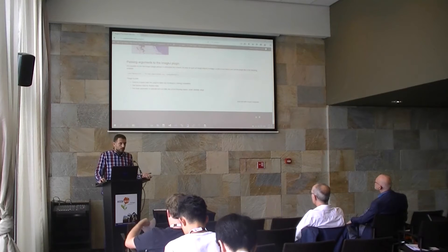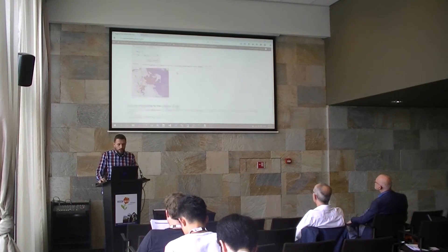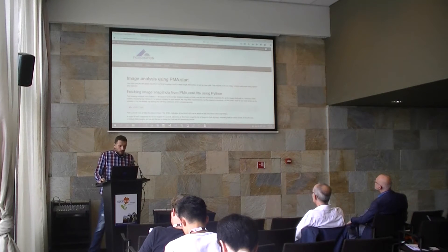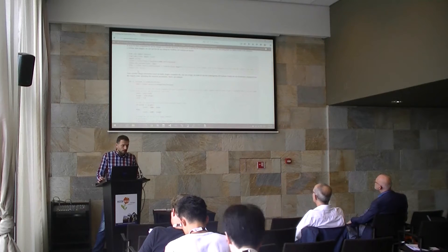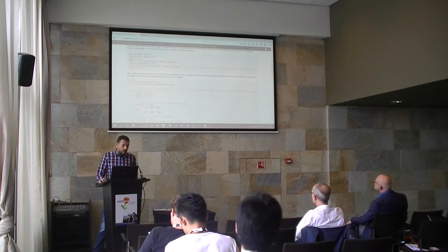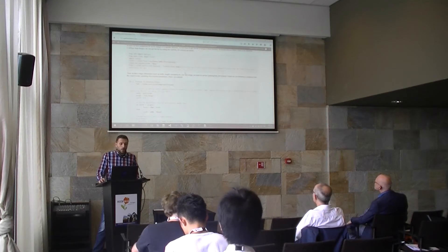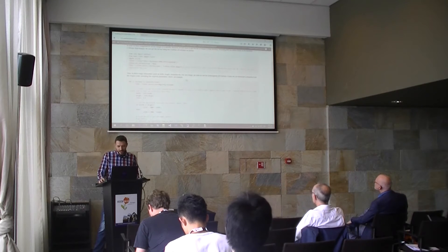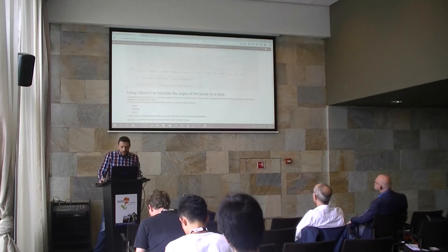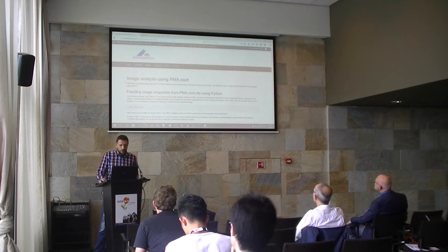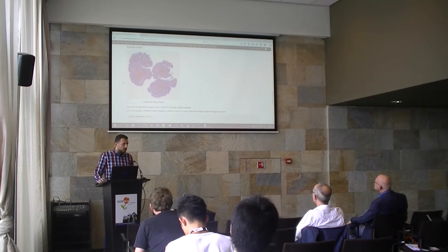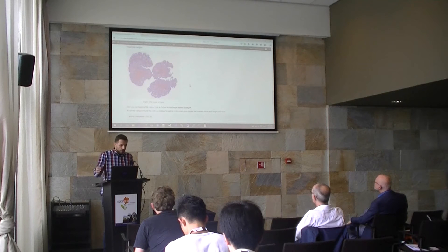All this information is available on our website, and if you have any questions or feature requests, you can drop us a line and we'll take care of it. One more thing I'd like to show you is a sample using Python to load images from PMA Start. We did a small example of how one can do some simple image analysis. All the code, samples, and scripts are available on our website. The script communicates with PMA Start, loads a couple of images, and runs a thresholding algorithm to do some much detection, using OpenCV and storing results in a given folder.